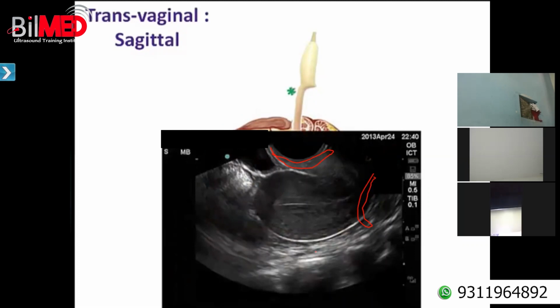Now, does it mean that the machine has rotated the image by 90 degrees for your comfort and convenience, because you are always used to seeing this footprint on the top? Now, another question from this question.